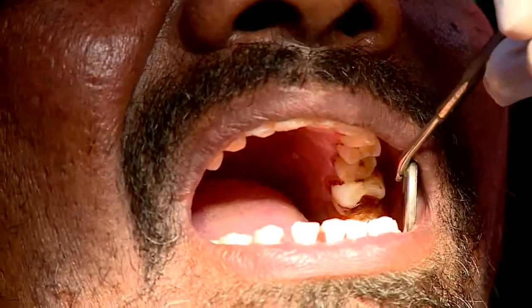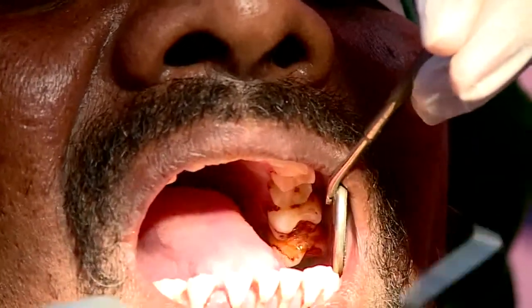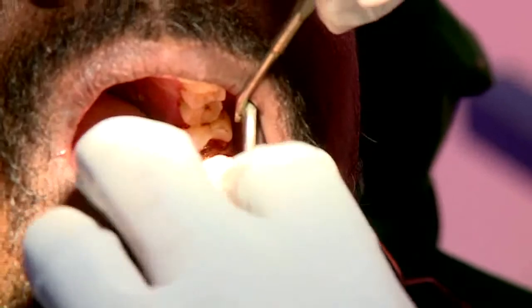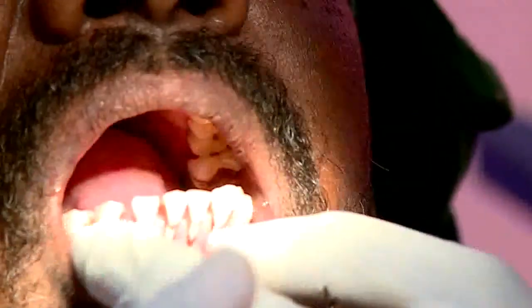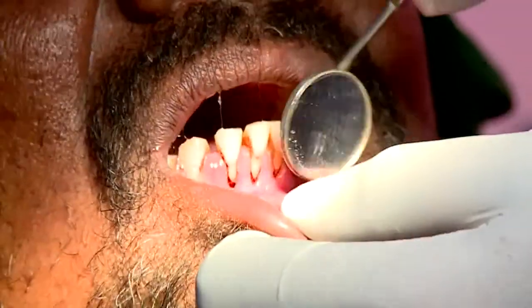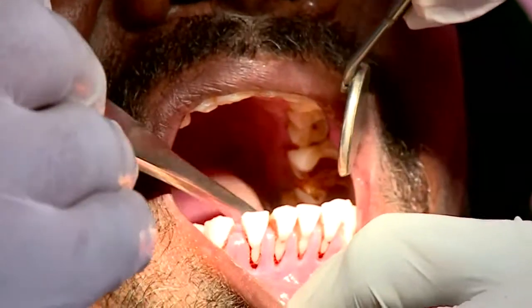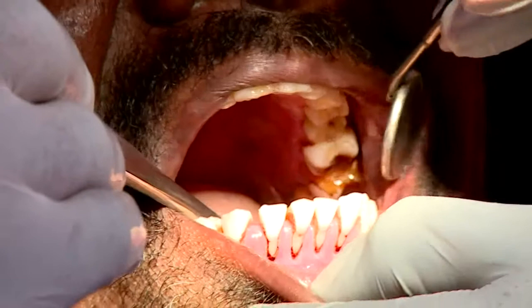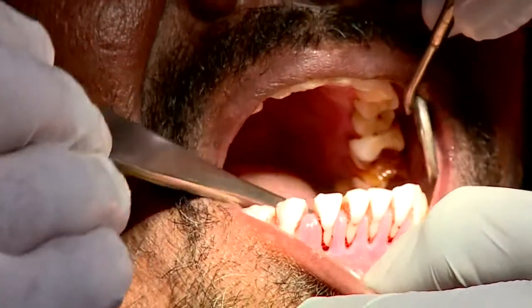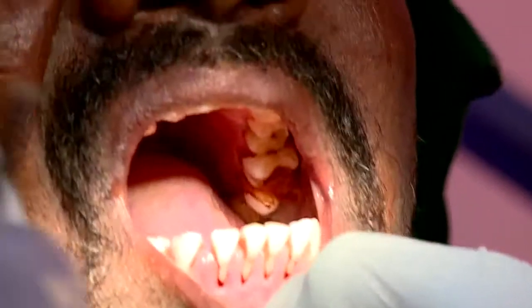I'm reflecting the tongue. Very good. So now is it visible? No, doctor. I think it's going to be a little difficult visualizing that region. Okay, fine. So we'll leave the retromolar region.